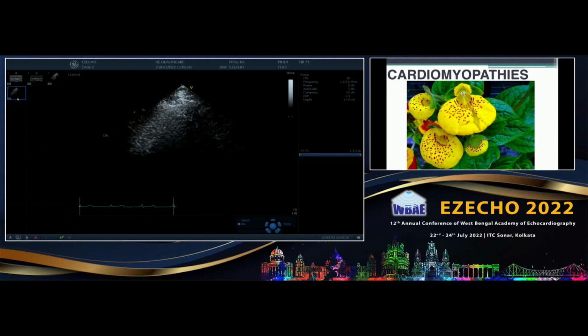So the echo probe has different penetration than the linear probe. So we have to decrease the depth, and the first thing is keep your hand very still. There are 4 zones on the right side, 4 zones on the left side, and you can also do posteriorly. What are the 4 zones? If you put a line in the parasternal and in the anterior axillary line: 1, 2, 3, 4. 1, 2, 3, 4. Generally, zone 3 on the left side coincides with the heart, so it is not very helpful.